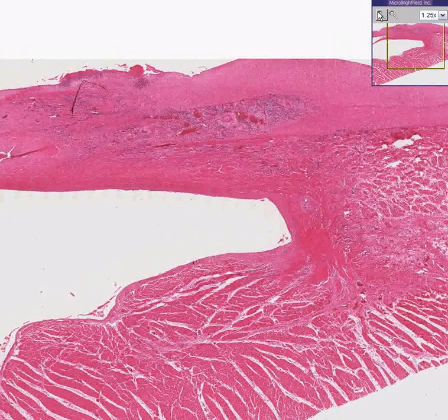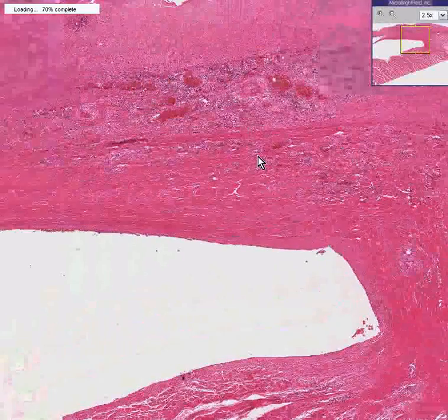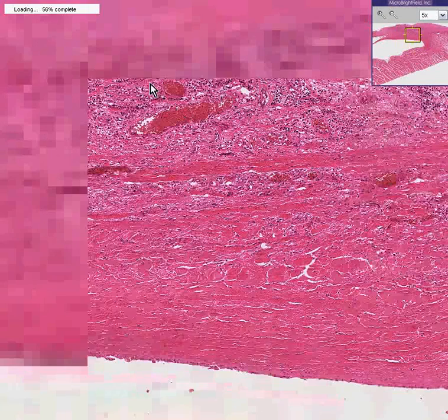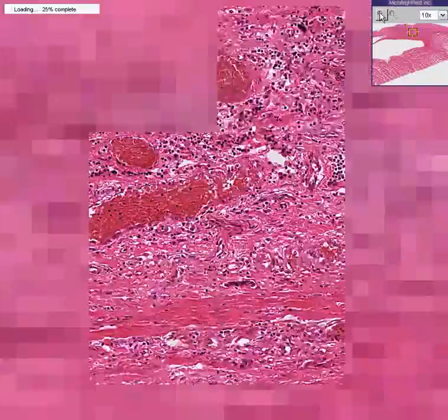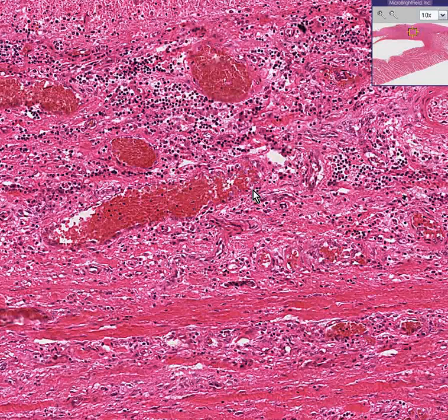This is called a subacute rheumatic endocarditis because it's not quite as acute as you would expect to see in extremely acute inflammation, in which you have infiltrates of nothing but inflammatory cells, perhaps edema. This is subacute. It's not chronic because there is not a considerable amount of fibrosis here. There is still some acutely damaged tissue, but it is not quite as acute as what you would see in an extremely acute process from a cellular point of view.